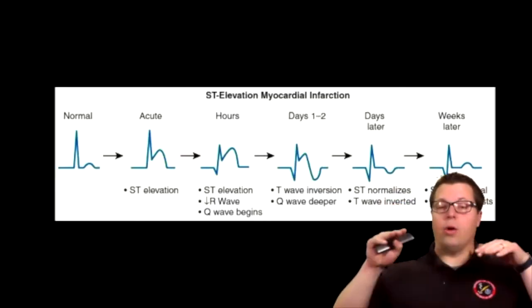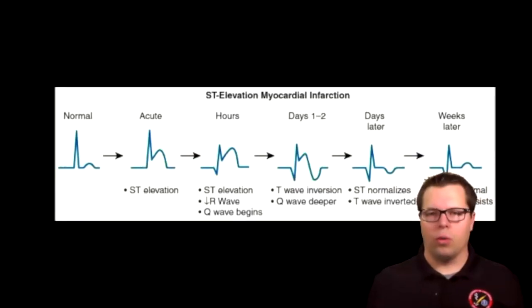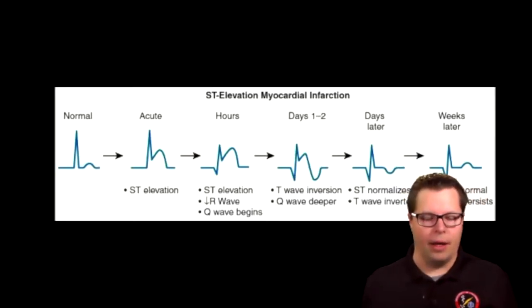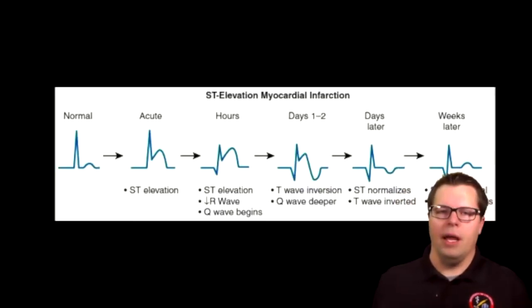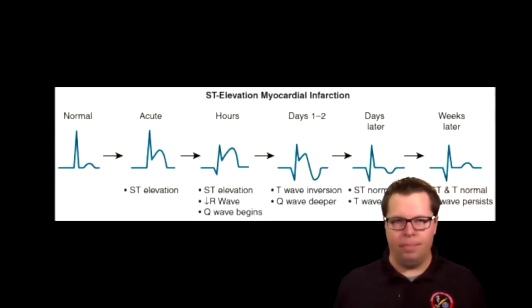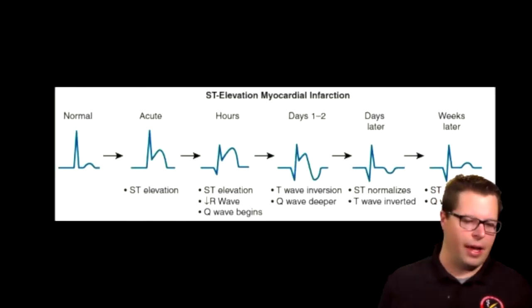Eventually, if you survive your STEMI, over the course of several days to several weeks, your EKG goes back to essentially normal, but with the addition of a Q wave. A Q wave is a sign that you had an infarct at some point, if it wasn't there before. A new Q wave is a sign that somebody has infarcted, but it's usually hours to days to weeks rather than in the first couple of minutes. So ST elevation does go through a different pattern. You can see changes even over the course of minutes to hours.